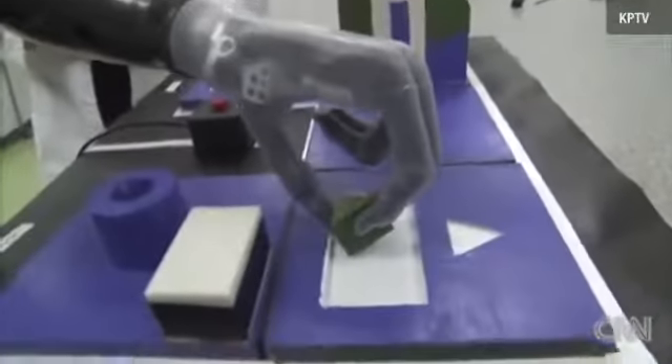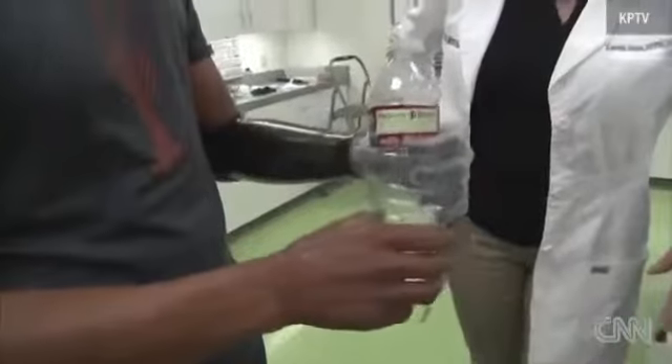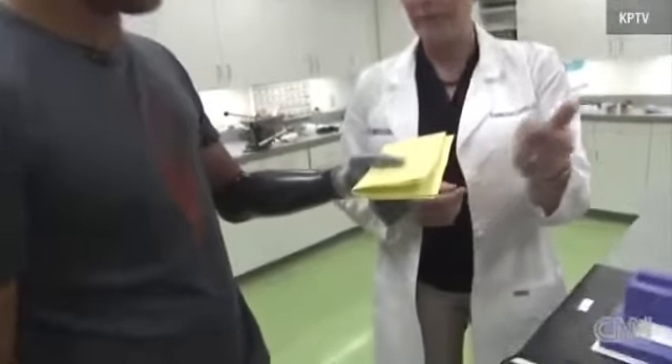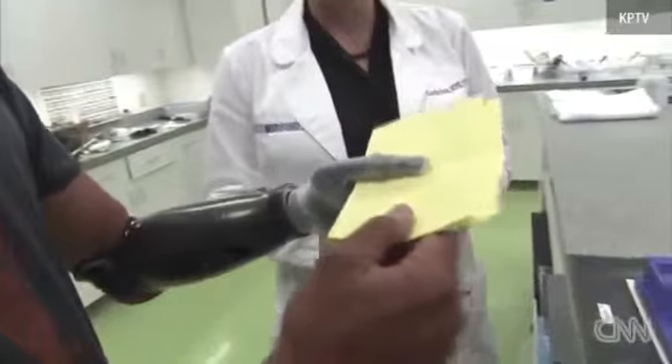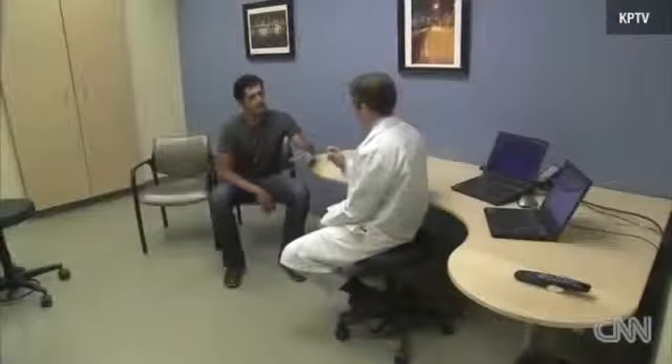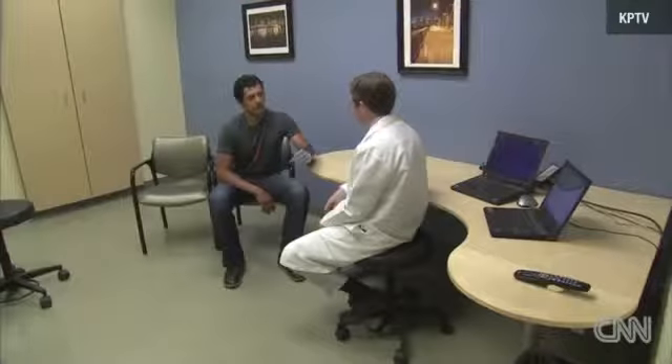He can even splay his fingers and use his thumb. The hand can grip in 25 different ways. It is motorized, wireless, and uses Bluetooth technology. And while it's not completely natural, it's as close as engineers have come. Mack Lang is working with Garcia to meet the chef's needs: "I go in and look at the microprocessor in the hand and make sure that all of the settings match what his abilities are and fine-tune it for him."